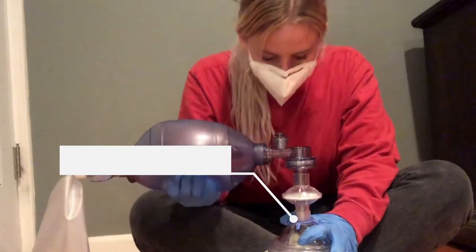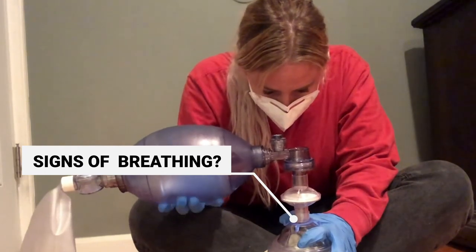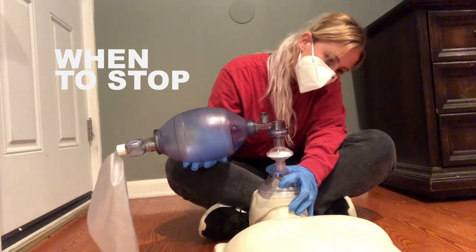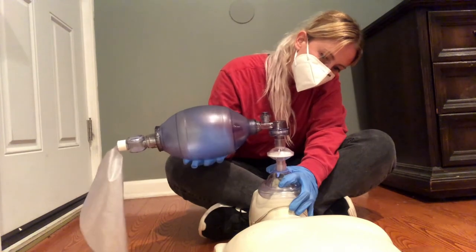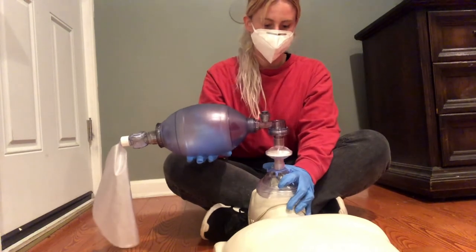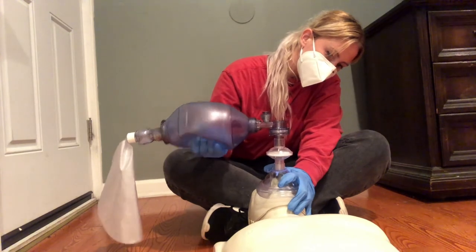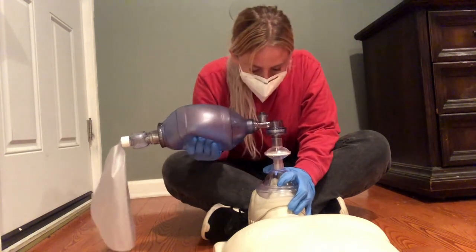Look for signs of breathing between bag squeezes. You will be able to see the exhalation as condensation and hear it flowing through the mask valves. Continue operating the bag valve mask until the person starts breathing again on their own or until first responders arrive. It's important to practice using a bag valve mask before using it while responding to an actual overdose. Practice with another person or use a dummy if you have one. That's how to perform rescue breathing during an overdose using a bag valve mask.